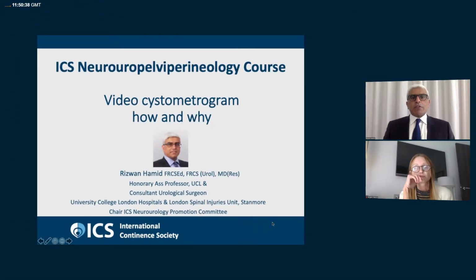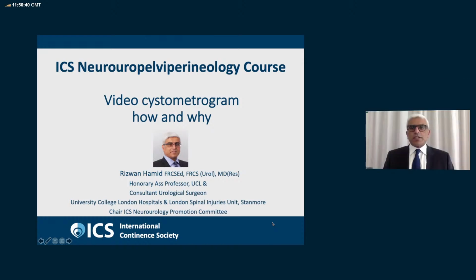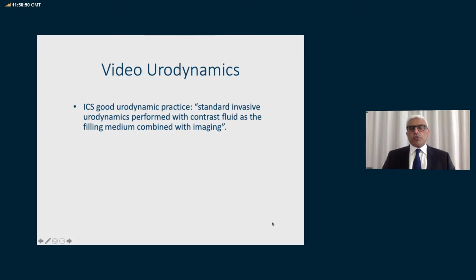Okay. So the second presentation is on the video cystometrogram, how and why. Again, what is video urodynamic studies? It is urodynamic studies along with imaging or X-rays.